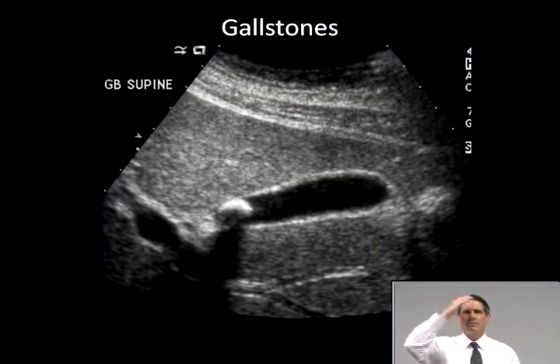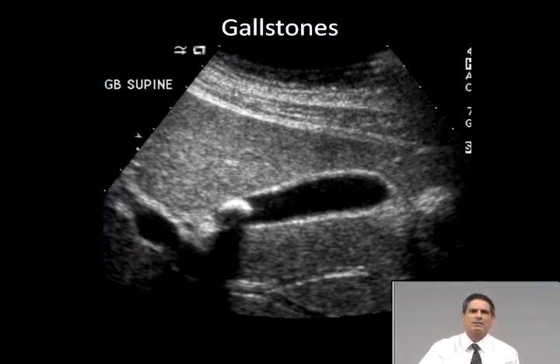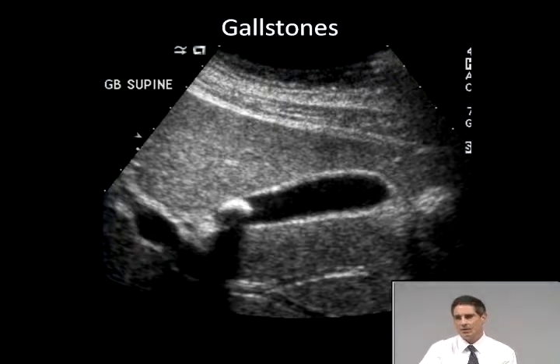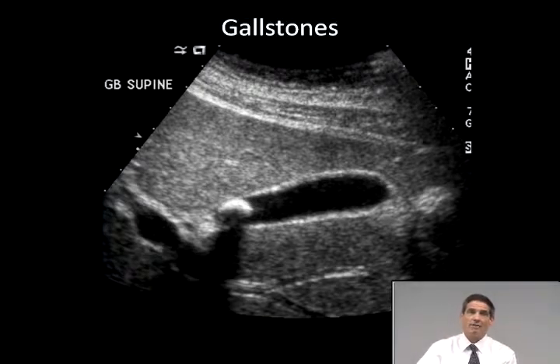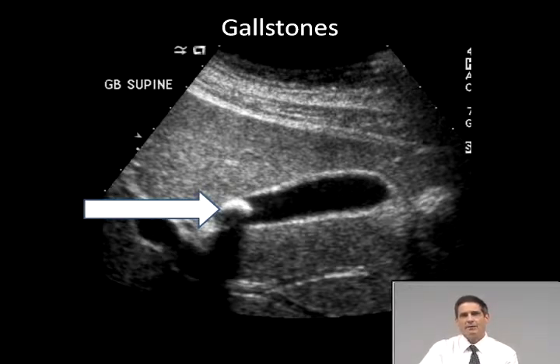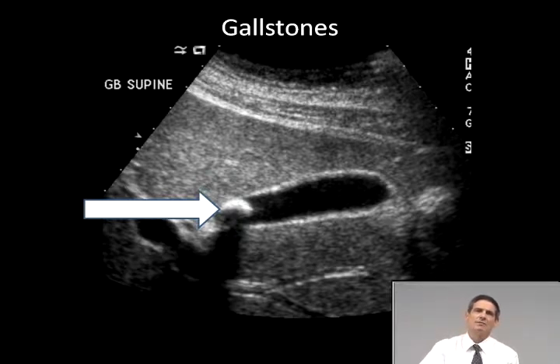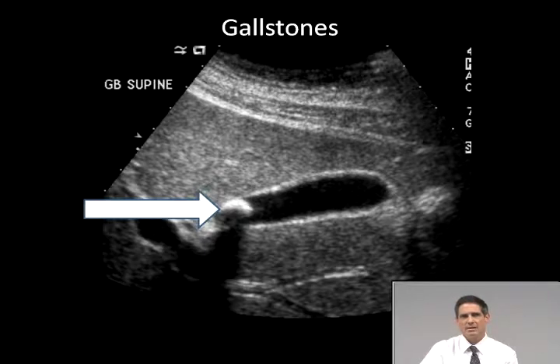Here's an image of a gallstone. The first finding to look for in someone with right upper quadrant pain is a gallstone or gallstones in the gallbladder. Stones — especially accompanied by a classic history, positive physical exam, tenderness over the gallbladder, a positive sonographic Murphy sign, or imaging findings like the stone lodged in the gallbladder neck, gallbladder wall thickening, or pericholecystic fluid — are pretty likely the cause of the patient's symptoms. Here's the gallstone with an arrow showing it as a filling defect in the gallbladder with posterior shadowing. However, many people harbor asymptomatic gallstones, so gallstones plus right upper quadrant pain don't always equal acute or chronic cholecystitis. When pain is atypical or not accompanied by other imaging features, you should consider alternative diagnoses like gastroenteritis, duodenitis, or ulcer disease, and sometimes endoscopy before surgery.